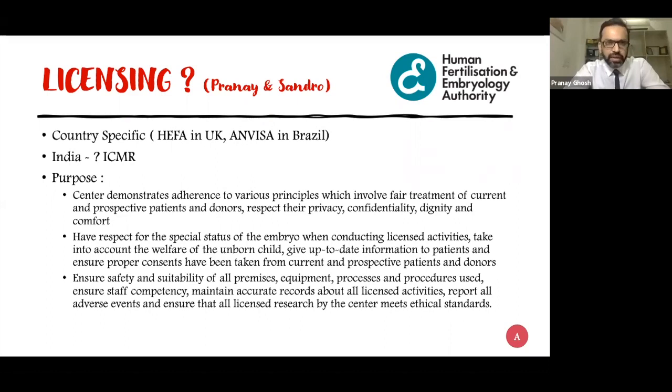It just says that the air needs to be filtered. You need to have adequate air changes. So that's the difference between the various licensing directives that we have. So basically, the bottom line is that the expectation of the regulatory authorities should be met. And it is the job of the person responsible or the program director to make sure that whatever you're doing in the lab is in accordance with the provisions of the regulatory statutes, and you're meeting out treatment for the patient, you're following the evidence-based guidelines, you're providing the information.